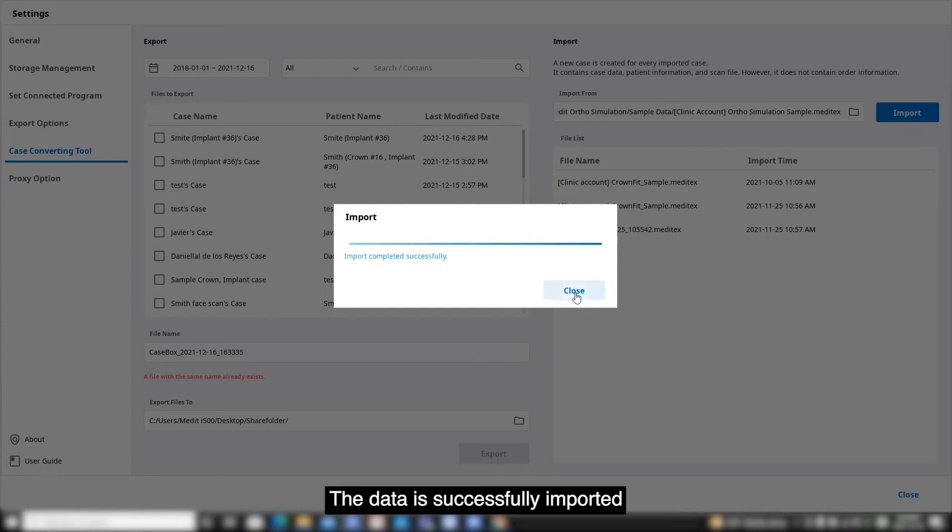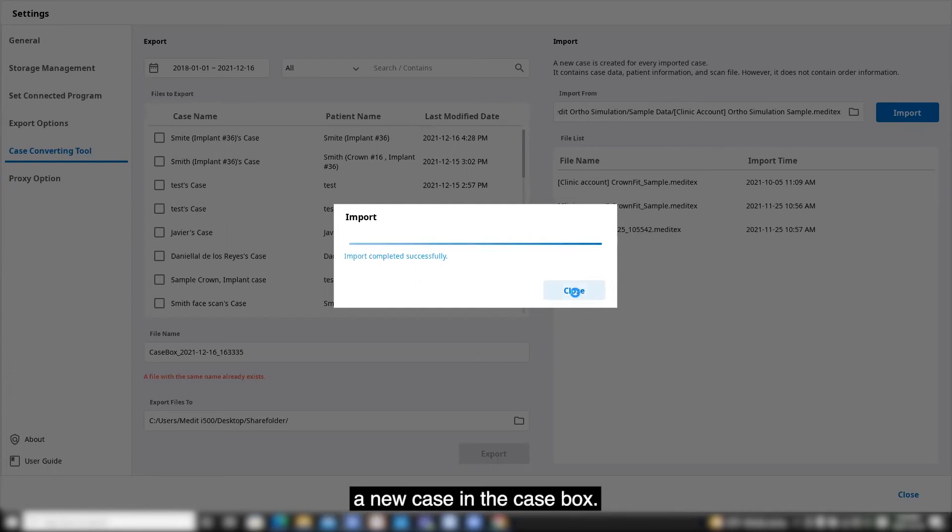The data is successfully imported and it will create a new case in the case box.